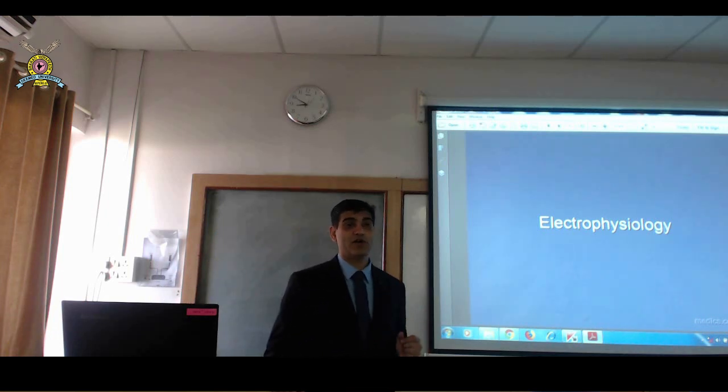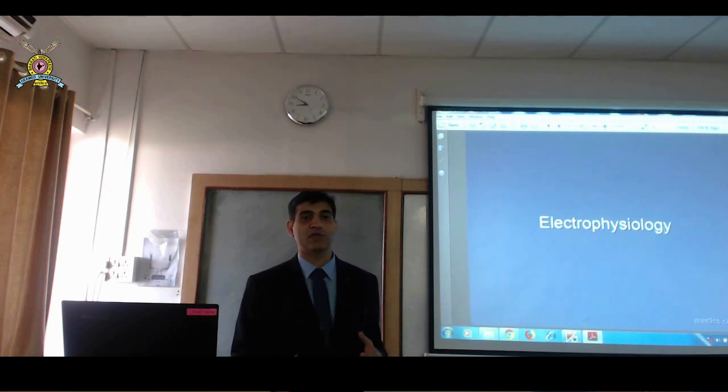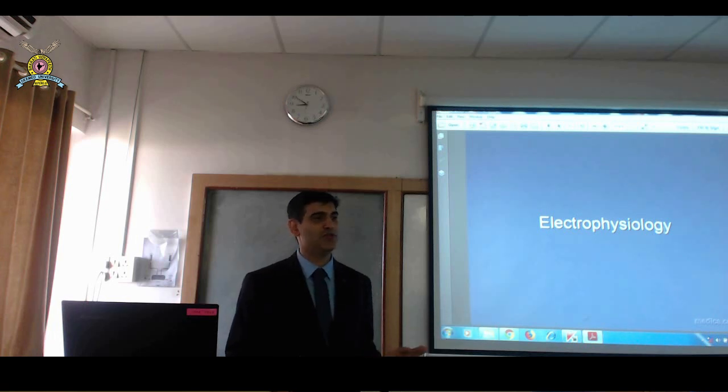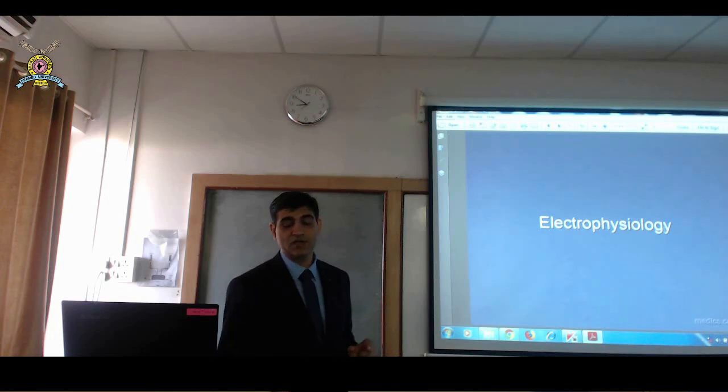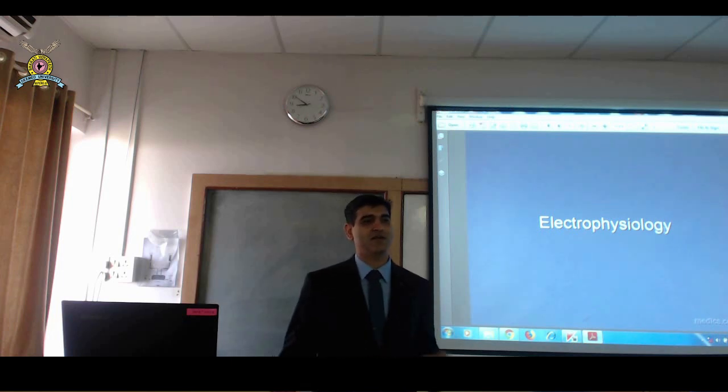So we were doing an echocardiogram on a lady, a 65-year-old lady, and my assistant was doing the echocardiogram on her, and we were trying to figure out where the heart is. What I do is I don't do echo without seeing an ECG. Many times, many doctors will send a patient for echo without doing an ECG. Have you come across this situation? There's no ECG done and they want an echocardiogram. Don't do that. First do an ECG, then send the patient for echocardiogram. Whenever a patient comes for echocardiogram, I always want to see the ECG. If there's no ECG done, I'll get the ECG done and then do the echo.